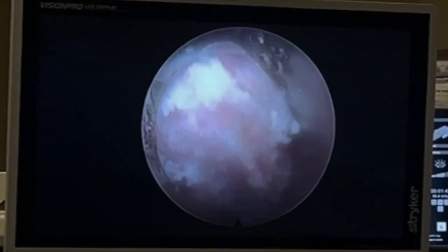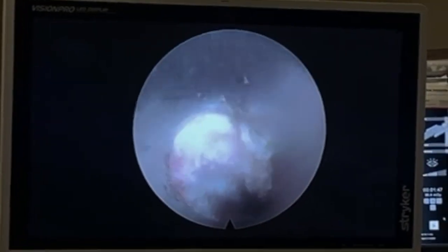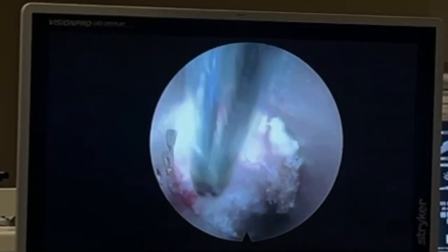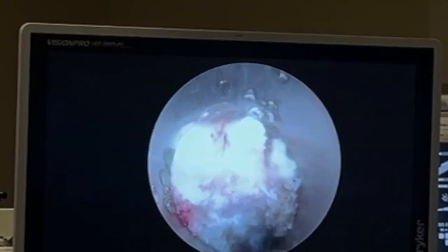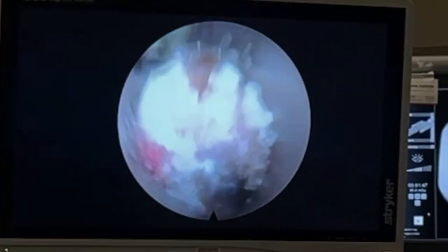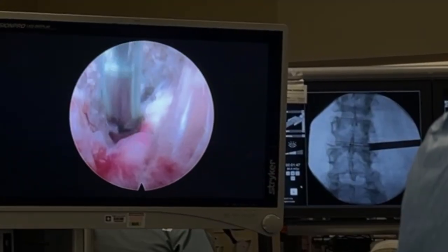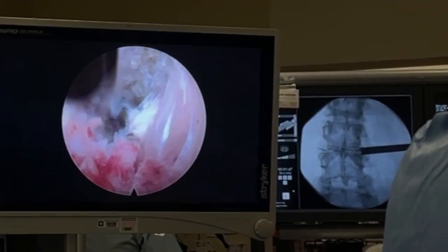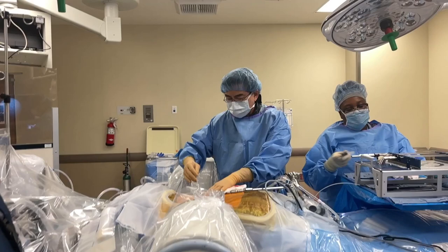Backing out, hugging the facet joint, or the lateral aspect of it, where all the dorsal rami nerves live. These nerves get buried in inflammatory tissue. If you've ever had a rotator cuff tendonitis, you'll know how painful that is. And part of the reason this surgery works so well is that we're treating that chronic inflammatory condition. Alrighty, next, doing the next level, L2-3.